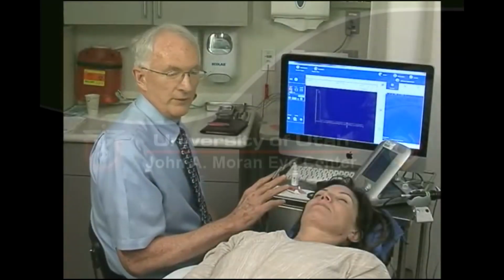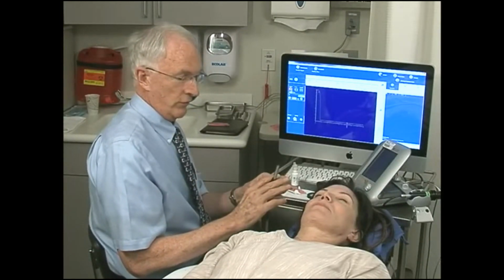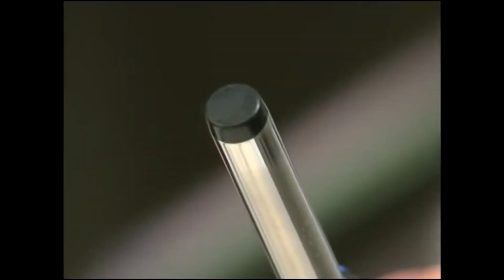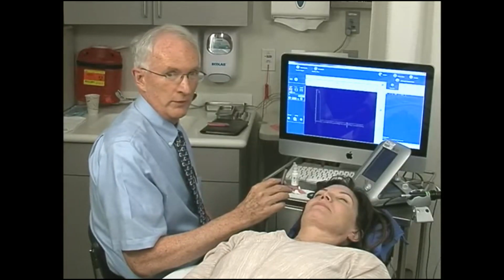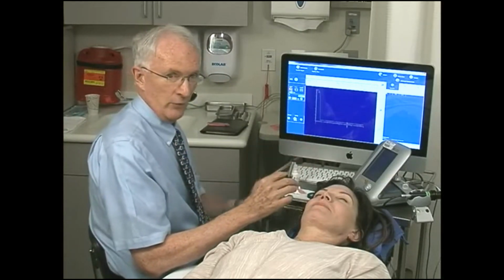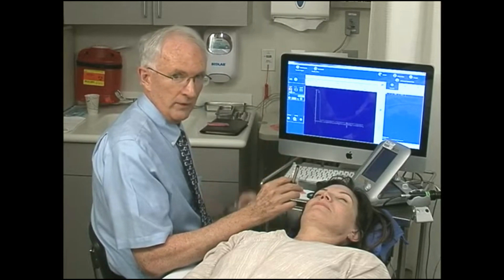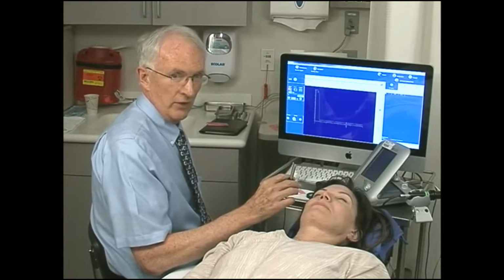I'm going to demonstrate the use of the diagnostic A-scan probe. It's important to know that this is not a biometry-only probe. This can be used for biometry, but it's also used for what's called diagnostic A-scan of both the globe and the orbit. This is a separate probe from the B-scan probe. Some units have a combined A and B scan probe in the same probe, and there's a vector display at the bottom of the screen.